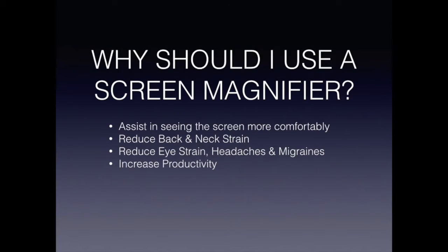We often ask, why use a computer magnifier? The purpose of a computer magnifier is to assist seeing the screen better, comfortably, reduce eye strain and physical fatigue such as back, shoulder, and neck strain. It will also help to alleviate headaches, migraines particularly. My experience with clients for any period of time behind a computer is they will develop eye strain, which will then lead into a migraine or a headache. Also, they are used to be more productive and efficient, especially at their work environments.